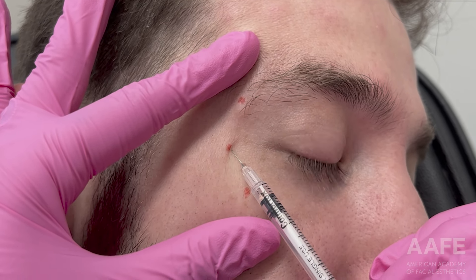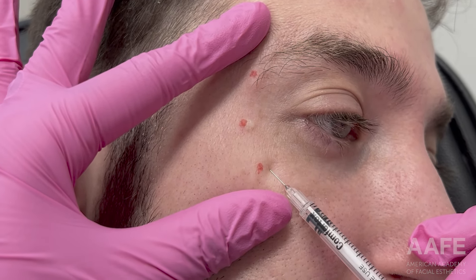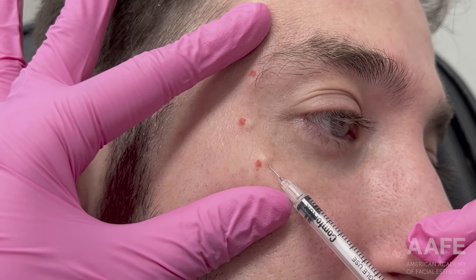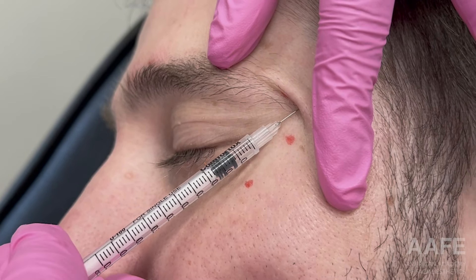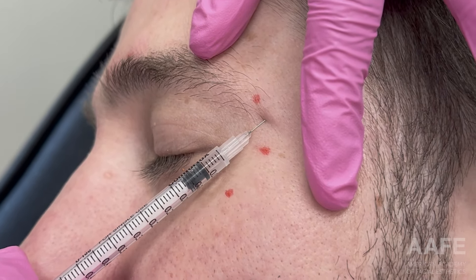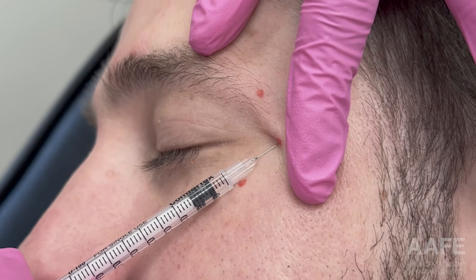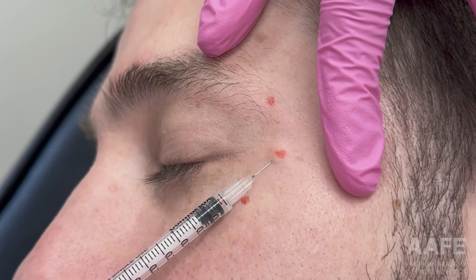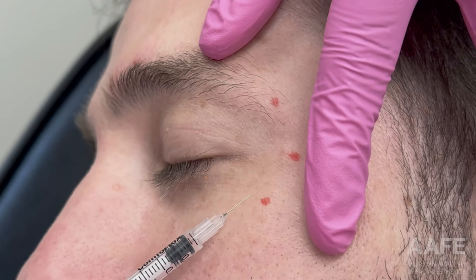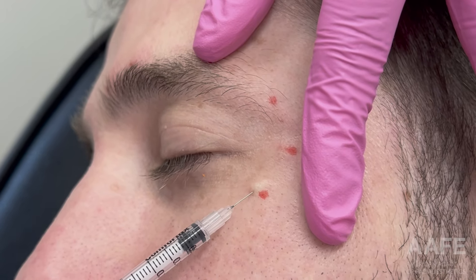Next we injected the crow's feet. I had the patient smile and drew my dots where movement was happening. I'm pulling taut on the skin and injecting at a 45-degree angle, making sure this injection is very superficial — the tissue should almost bleb around it. As you can see, I have a little bleb like a TB test, which is completely normal and means you're in the right plane of tissue.